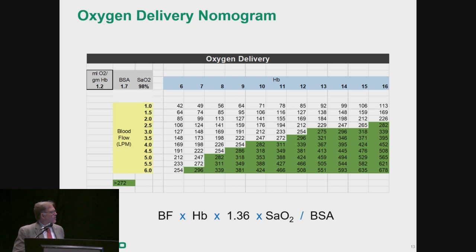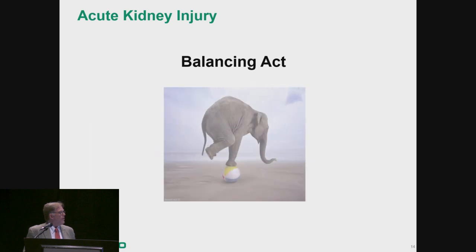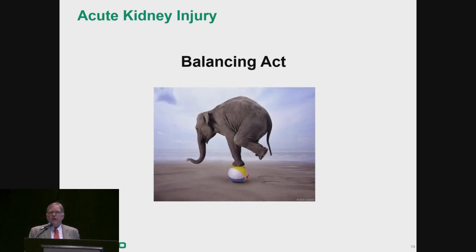But you can see also, if I take my cardiac index up to an index of 3 on this and flowing 5 liters a minute, you can see what that does for my hemoglobin level. Gives me a lot more latitude in that regard. So it shows the relationship, and it shows how the numbers can work together, and that's what makes it so valuable as a tool for perfusionists. So you already saw my slide here, but it really is a balancing act of using what you can use to achieve that DO2 rating. It's either flow, hemoglobin.